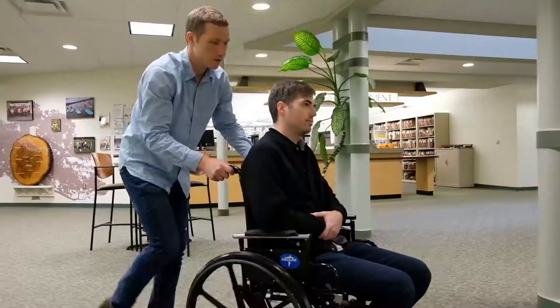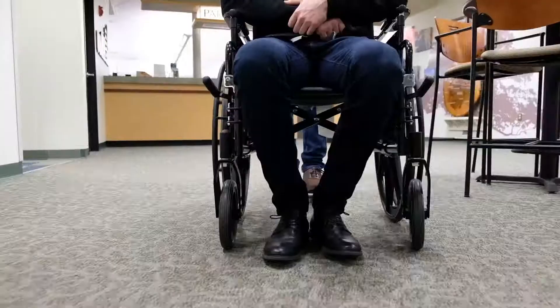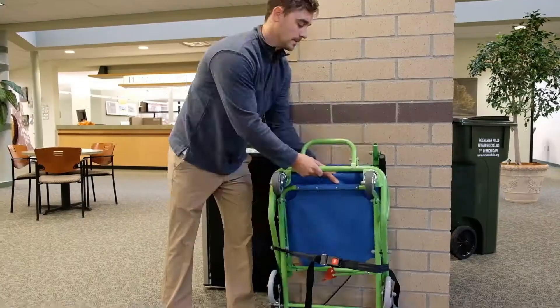The EvacuSafe three wheel transit chair is a light duty transit chair designed to go both up and down stairs in organizations such as care homes, primary schools and private residences.